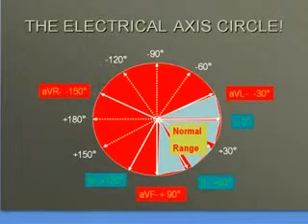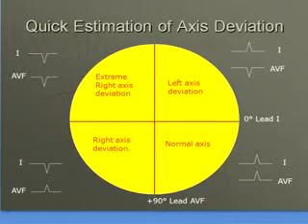So how do you estimate the axis of a particular ECG? A simple rule is helpful. We can identify the 4 quadrants to which the axis belongs instead of pinpointing the axis accurately at the bedside of the patient. You can take 2 leads. There are several methods available. One of the methods is lead 1 and AVF.